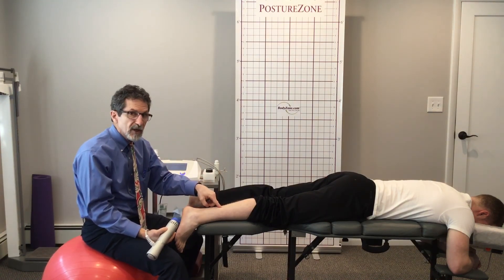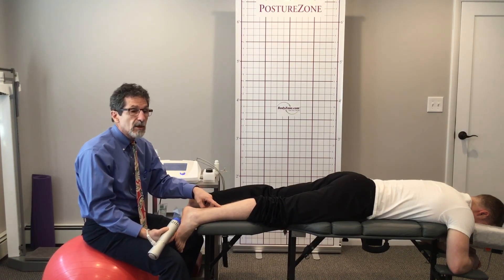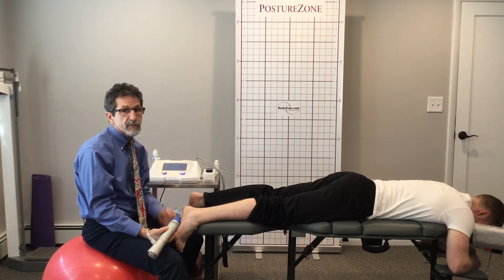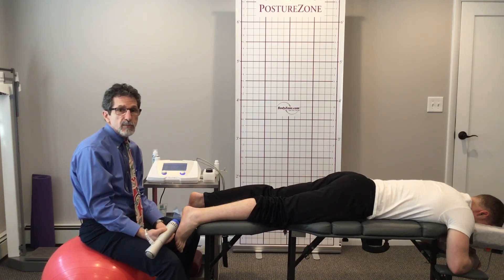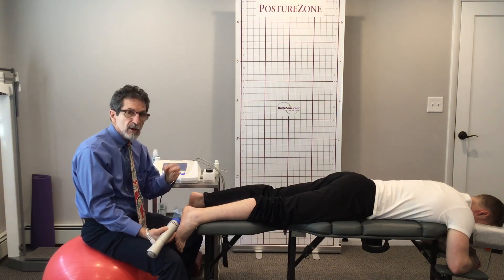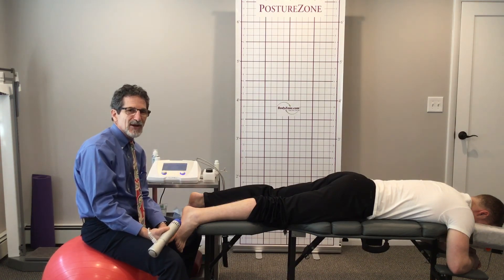We don't do this every day — in fact I may not do this for seven to ten days. We just want to get things to calm down. More isn't always better. So that's how we use our radial smart wave therapy system to treat plantar fasciitis in the acute inflammatory stage here in the office. Have a great day. I'm Dr. Donald Fabio.